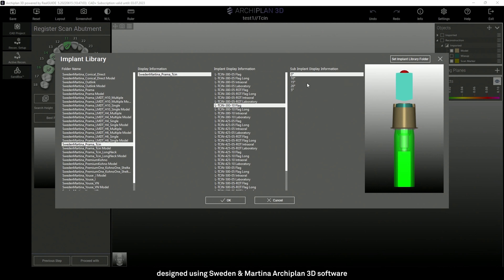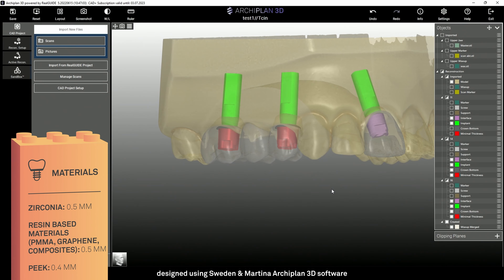In the third column, it is possible to select the degrees of inclination of the screw channel. By making the crown transparent, we can see the minimum thickness that the software creates around the prosthetic component.